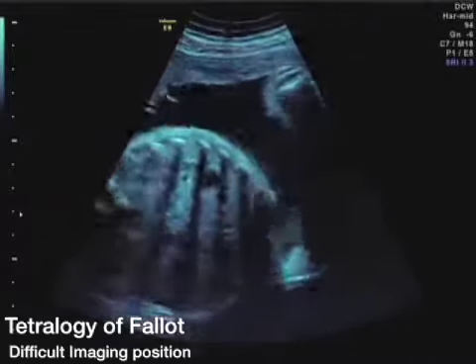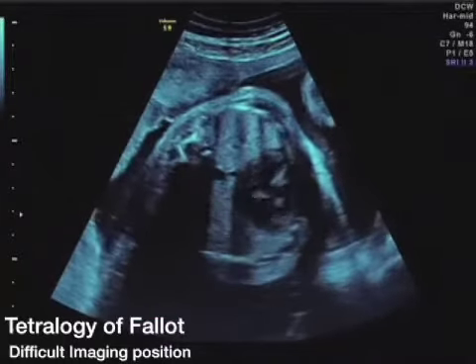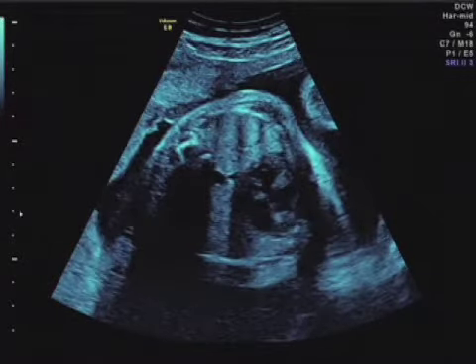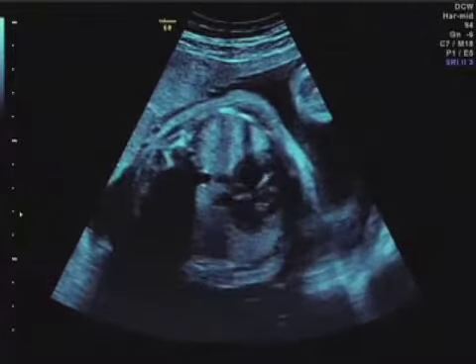This is a fetus where the difficulty is the position. We can see that there's a large ventricular septal defect, but it's difficult to otherwise see much in the heart when the baby's in this position. So we move the mom until we get a much better position.